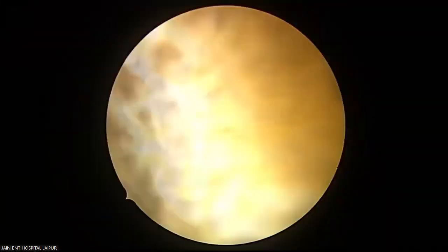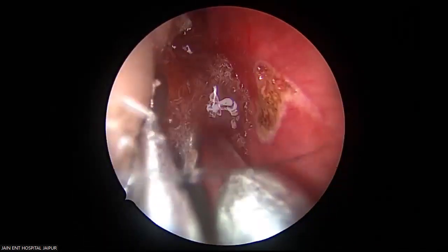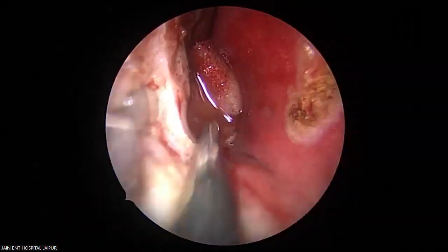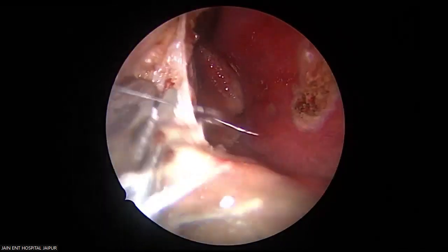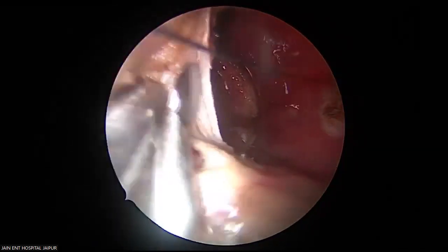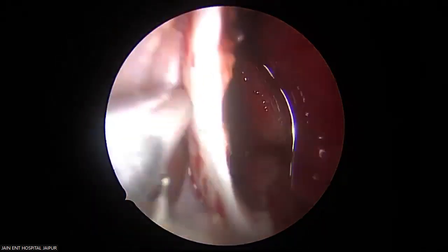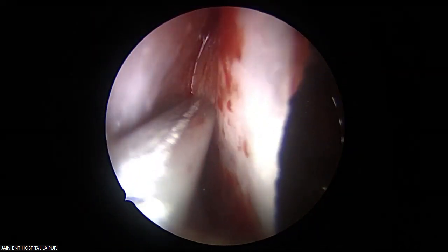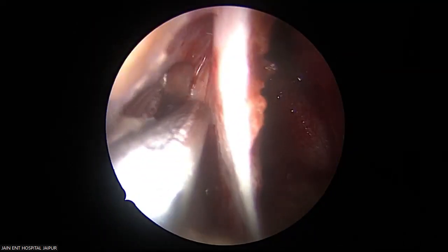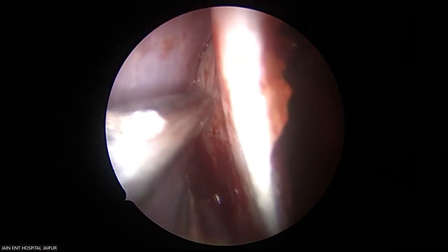Now we go to the anterolateral wall. And since the tumor is going far lateral, we need adequate anterolateral exposure. See, this is the piriform aperture. This is my subperiosteal plane. Maintain this subperiosteal plane as you go laterally. There you divide the anterosuperior alveolar neurovascular bundle.